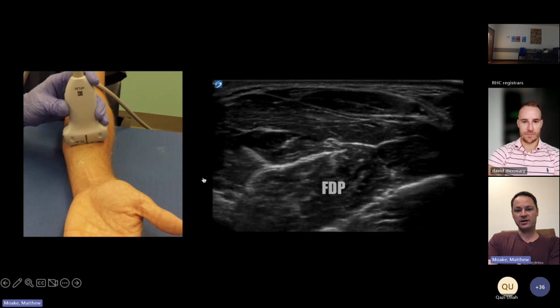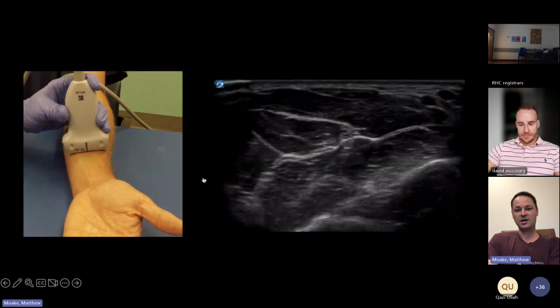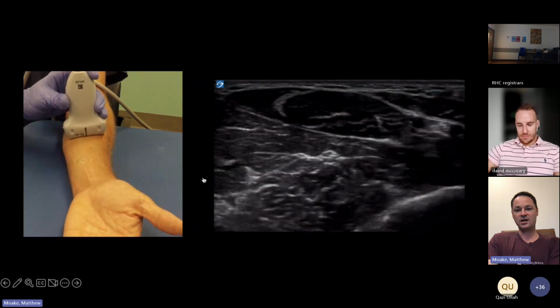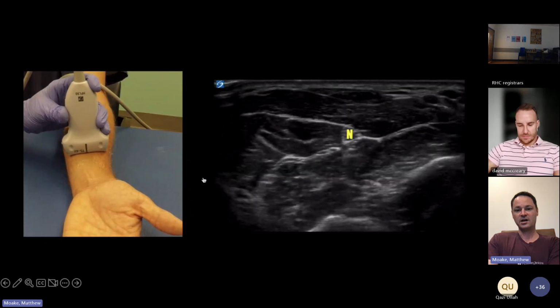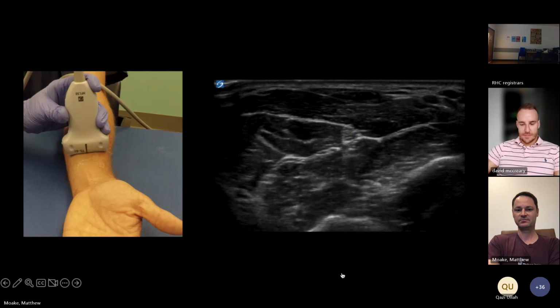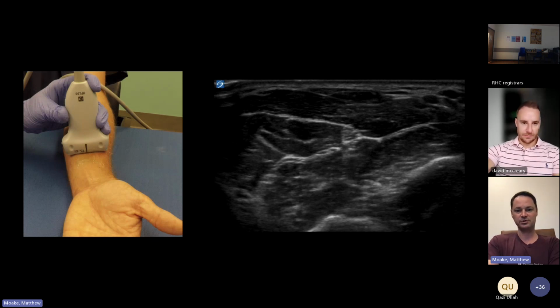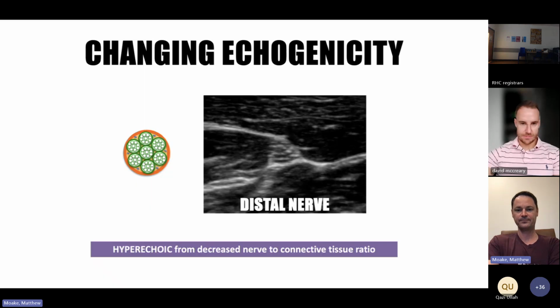So here we are scanning along again in that forearm. You can see those muscles and the nerve sitting in there. You can watch as that nerve changes tissue planes. Really, the goal of fanning along as you do any of these nerve blocks, whether forearm or anywhere else, is to help you feel good about the nerve, that you know exactly what it is. The goal of this panning is to make sure you feel confident you can see the nerve, that it is in fact the nerve, and that it's separating itself out from any obstacles around you. Median nerve, again, not too many obstacles for the most part. The other nerves are going to have more to worry about.